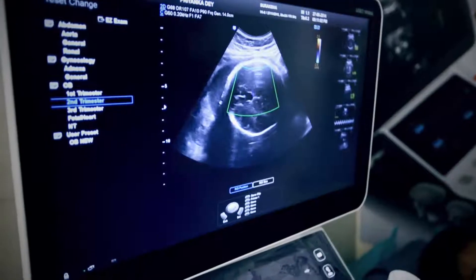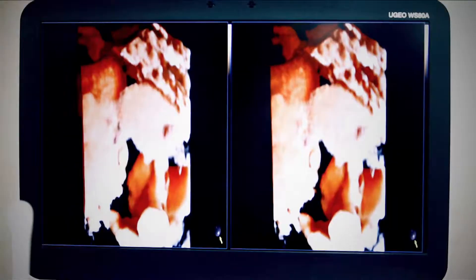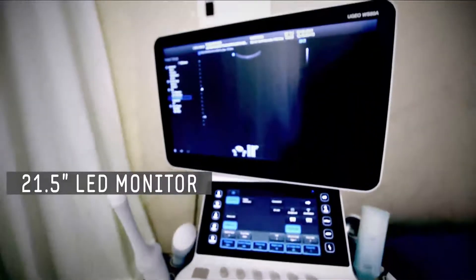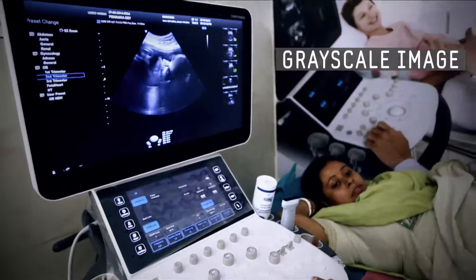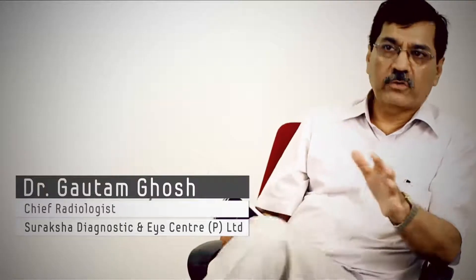One is the B mode — the basic B mode image. Then you have color pickup, how confident you feel that the color is there or not. And thirdly are the add-on functions. They have given us a 21-inch LED monitor that makes the image very big. The grayscale image itself leaves very little to doubt, and that is fantastic. There's no room for error there.